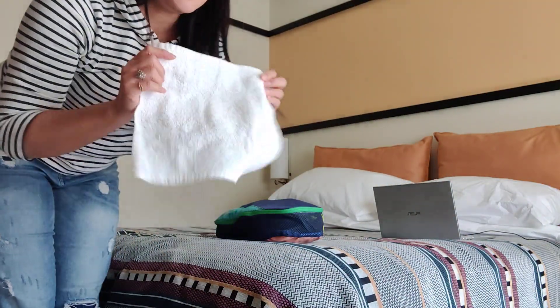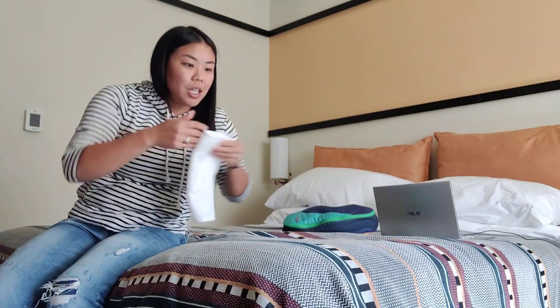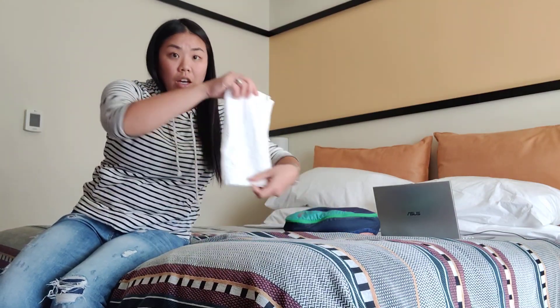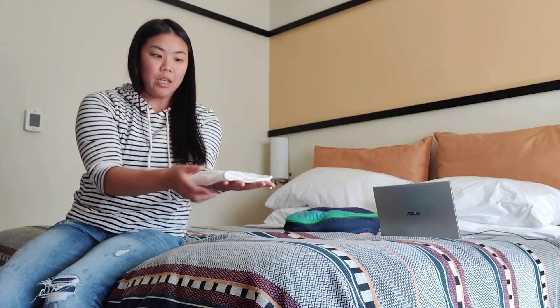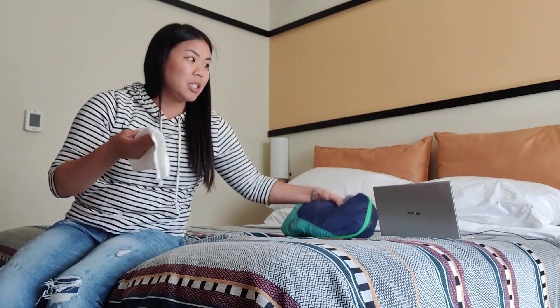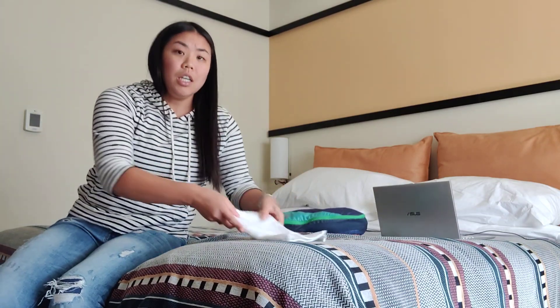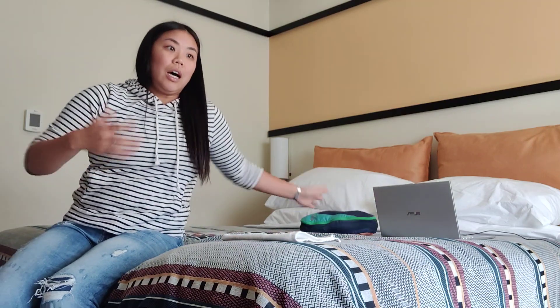You can fold a towel and have it in position so that when their hand goes on it, it's already there. I like to elevate slightly with a cushion if you have one; if not, it's fine to just have it flat.